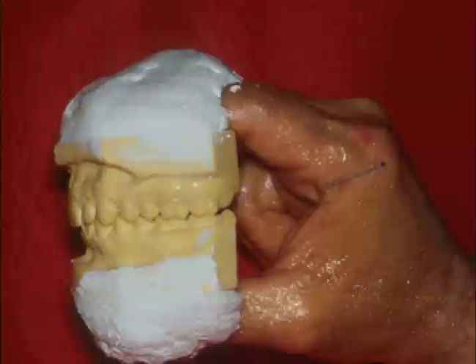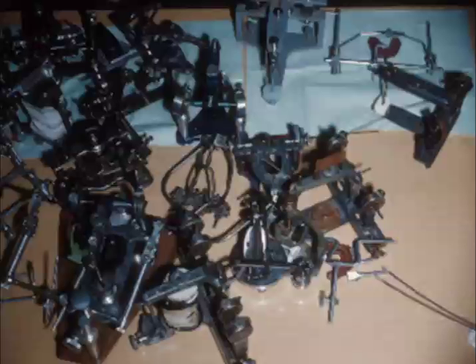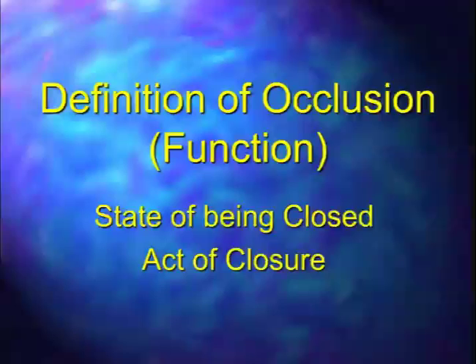Well, there have been many articulators developed to try to simulate these jaw movements, and some have joked around by using a barn door hinge, or even what they call a wristilator, or what I call the living articulator. But there have been many patents issued on different articulator designs trying to duplicate these jaw movements, or based on different philosophies of occlusion. What is occlusion or function?